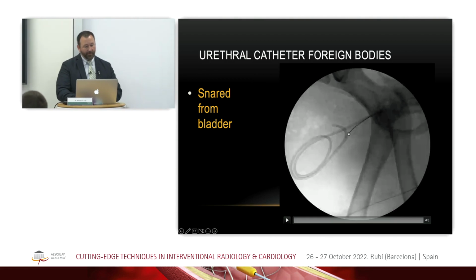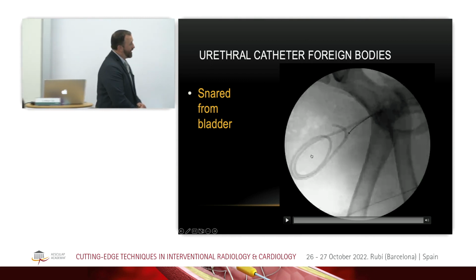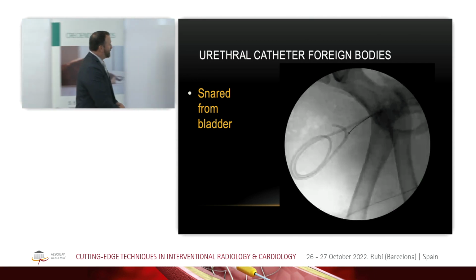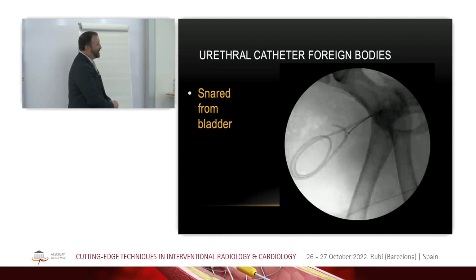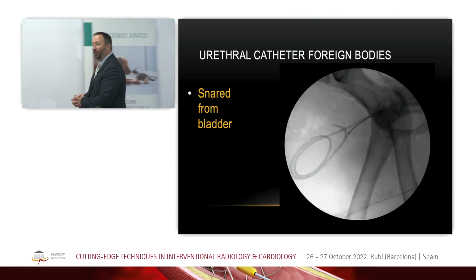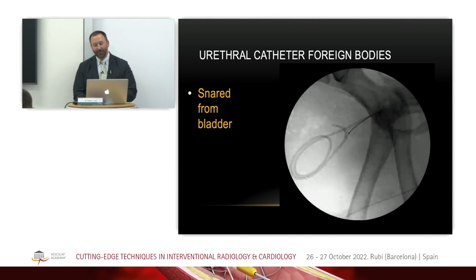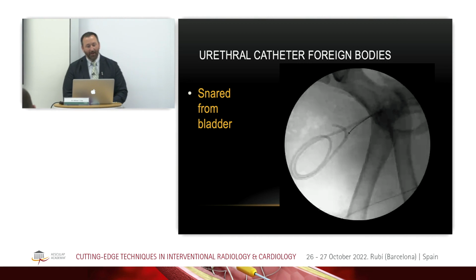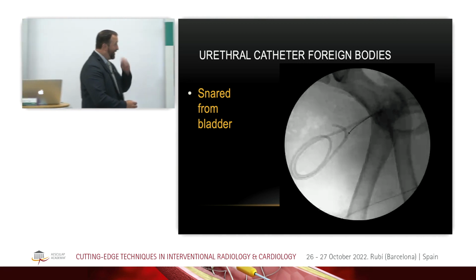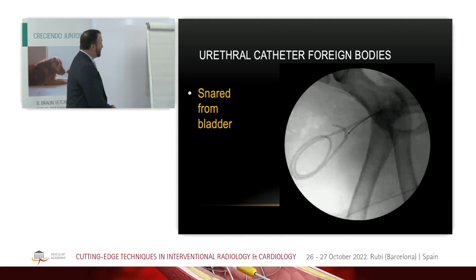Here's an example. This is a urinary catheter that was placed. Our neurology service tends to be my best supplier of these, because they place urinary catheters in every back and neck dog that they do. So you get these angry dogs that are down and have nothing else to do, and so they chew out their urinary catheter. Every couple of months they'll come to me and say that they have a case, so it's kind of fun for me.